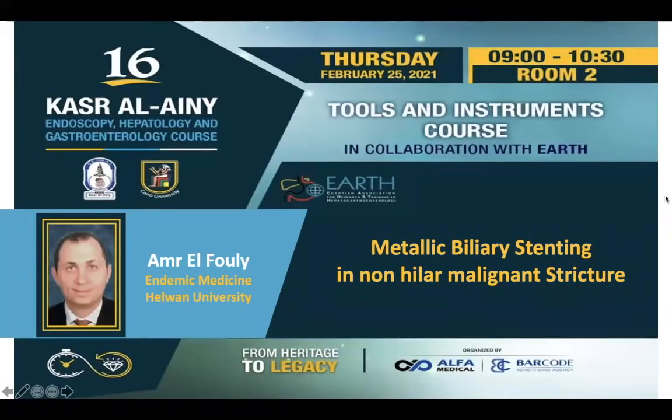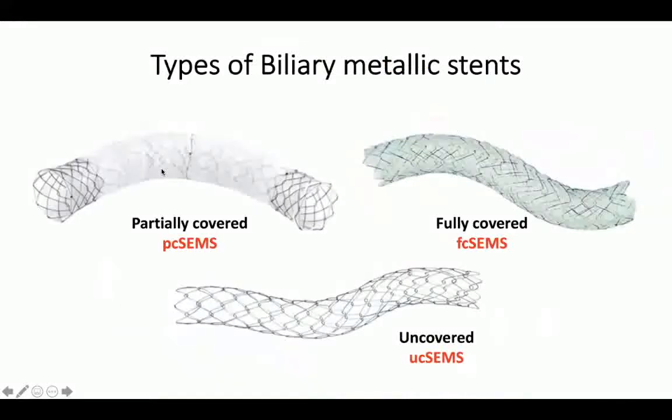My task today is to present metallic biliary stenting in non-hilar malignant strictures. Regarding the metallic stents, we have three different types. The first is the uncovered metallic stent, and the second is the fully covered metallic stent, which is covered with a silicone layer.